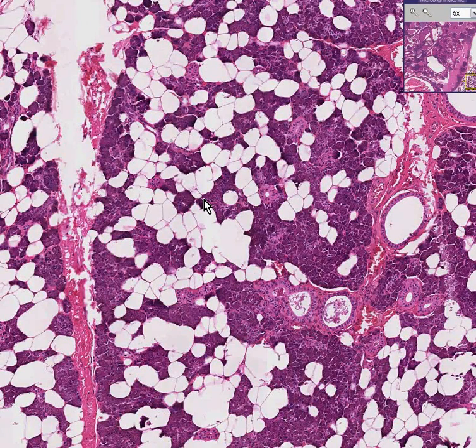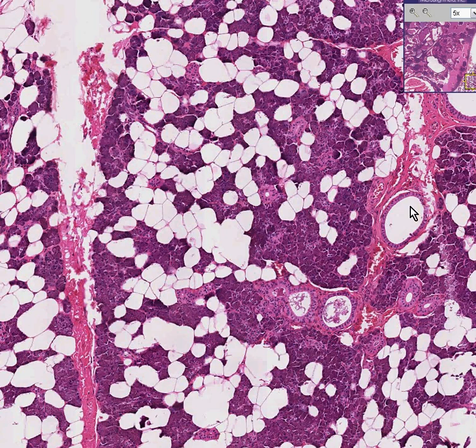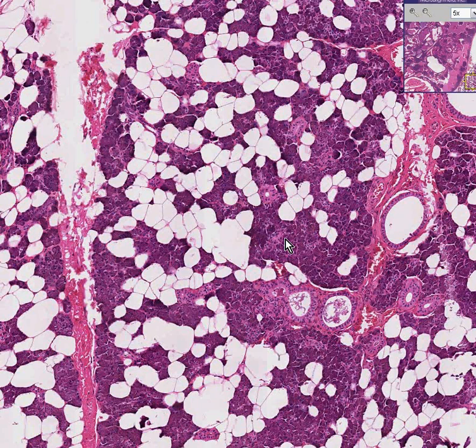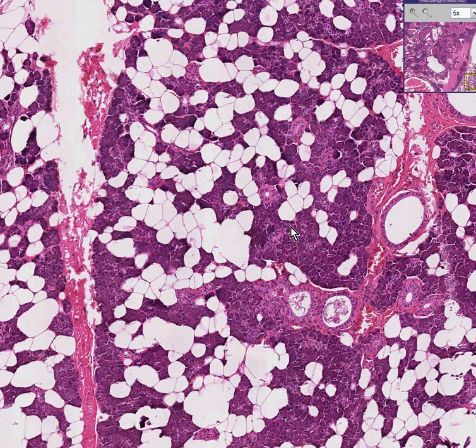Once again you could recognize this as classical, nice, normal salivary gland tissue. You could see some ducts between lobules, some ducts within lobules, fat, and acini. And because most of the acini look like they're serous rather than mucus, you could probably also say this was a parotid gland rather than a submaxillary or submandibular. Nice histology lesson.